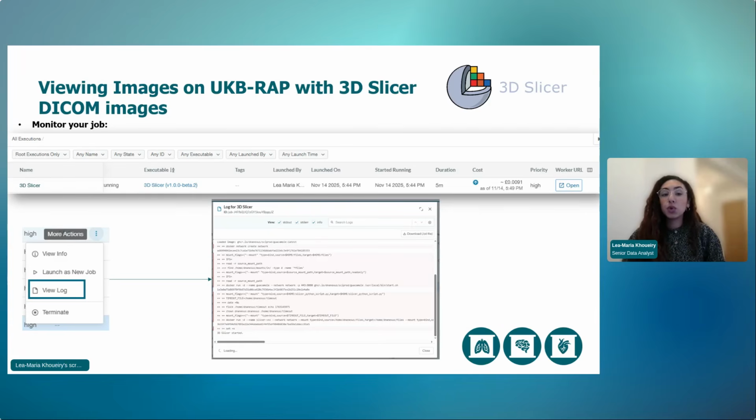In the next slide, I'm going to show you a screen recording of an example where I'm loading a DICOM image for the abdominal MRI, the Dixon images. You're going to see how I import them, and they are going to be loaded into the DICOM database.